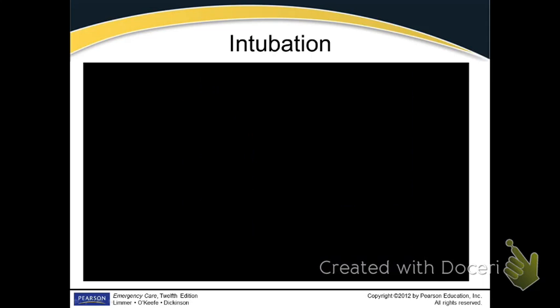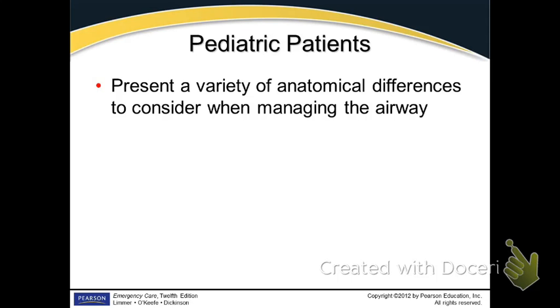So you can't talk or anything, can you? No, once the tube is in place, you can't speak. That's correct. And this patient was unconscious. The part where the jaw drops when you first see this is when they stick that big blade down their throat. They're going, oh my, because it looks sort of hideous.